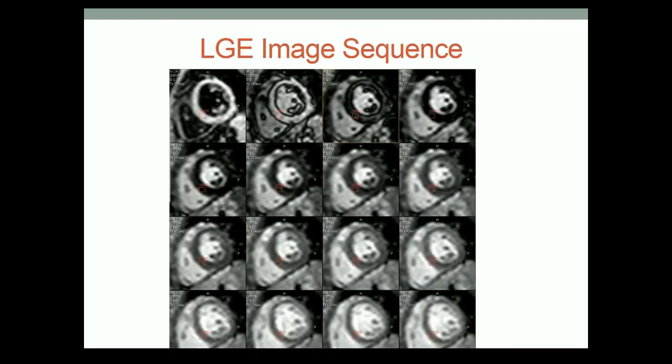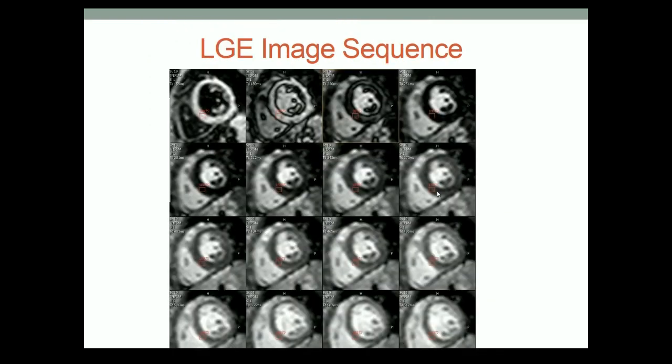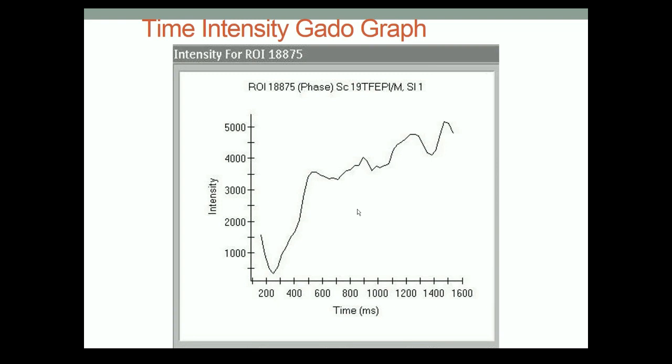In the sequence on our studies, we have to start at the end because it's reversed. We do the same thing, though. It's flipped down here and goes that way. You can actually plot this: this is white on white, and then going down this way we get intensity, gado, nulled myocardium, and then the myocardium becomes white, and then it's white on white again. This is about 250 on this particular patient, and we plotted it to show you what's happening in an area. You can pick an area and watch it. See, there's the area we picked, that little red box. Pick an area, plot it.